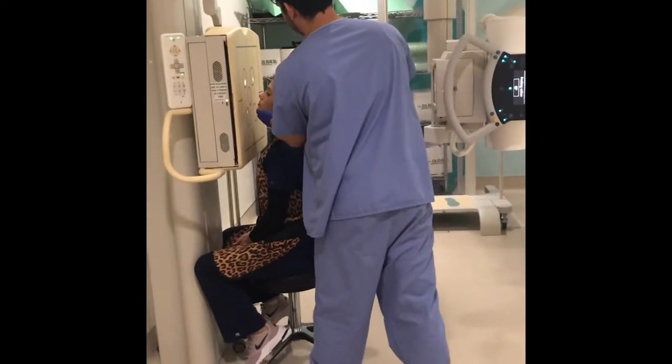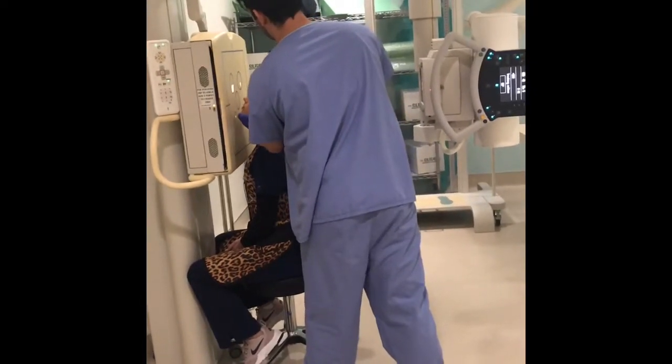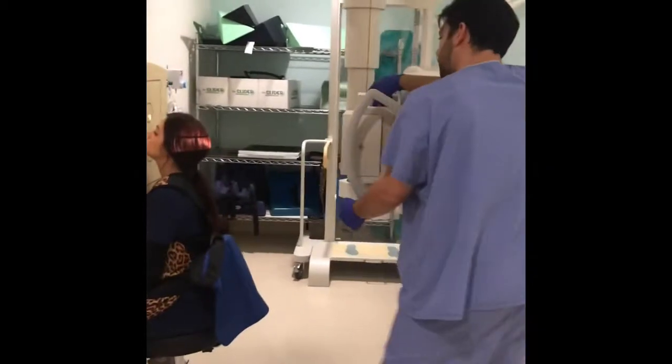So if you go ahead and lift your chin up and touch it against the IR for me. Perfect.